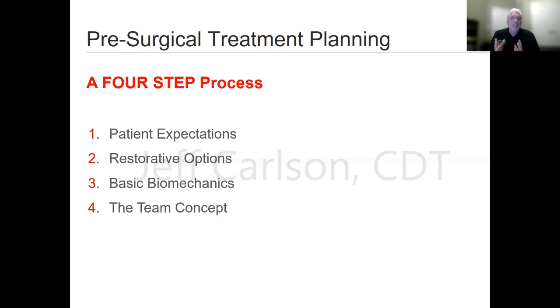I wanted to start by saying we came up with a very fundamental process that works very well as a minimum, a 4-step process. We broke it down to 4 steps: patient expectations being number 1, number 2 is restorative options, 3 is basic biomechanics, and 4 is a team concept.